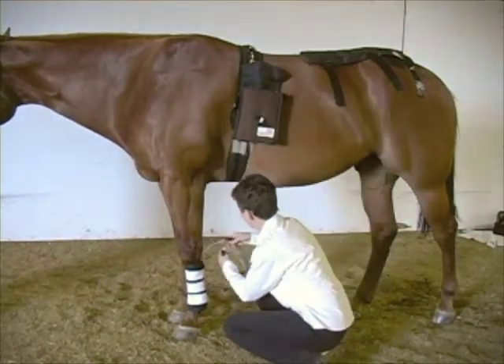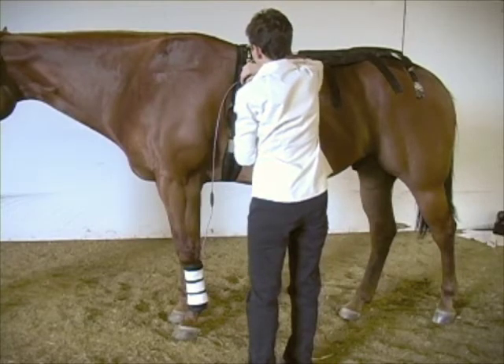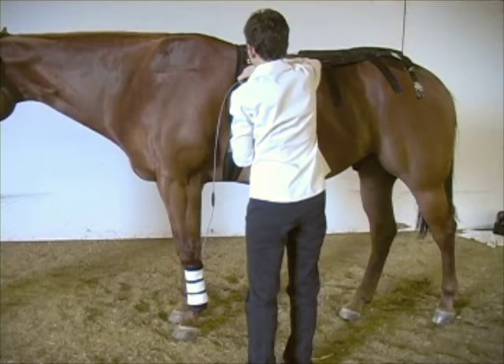Attach the cable first to the leg pad and then attach the cable to the system. Set the time and amplitude. A typical treatment time is 20 minutes for each leg. It is advisable to treat both legs even if only one leg is injured.